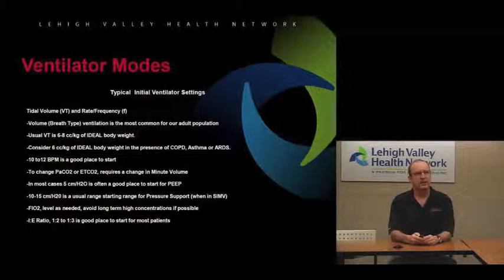To change your arterial CO2, or if you're monitoring your end tidal CO2, which we should be for every ventilated patient we're transporting, that requires a change in the minute volume. And that's going to be up to you, the one operating the ventilator, whether you want to change your minute volume by changing your rate or by changing your volume, whichever seems a little more out of whack. That's the one you probably want to change.